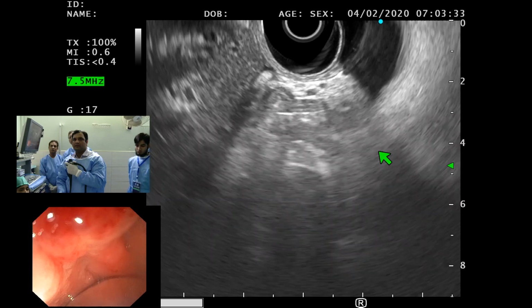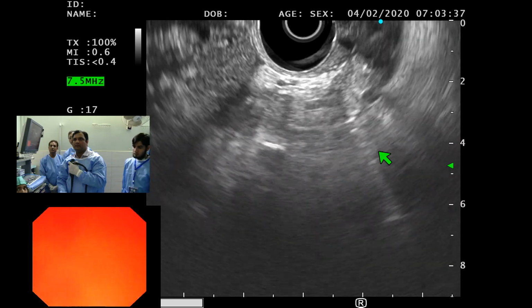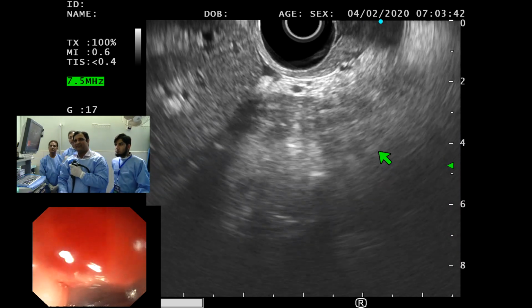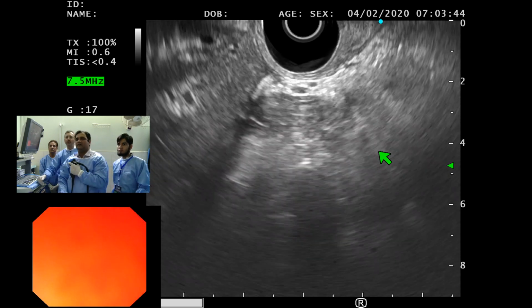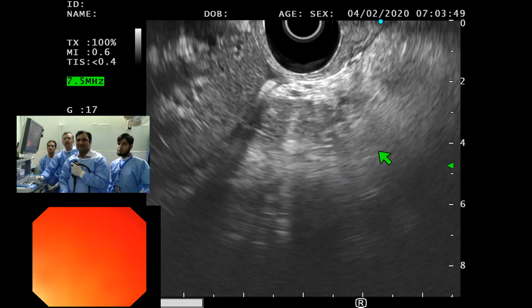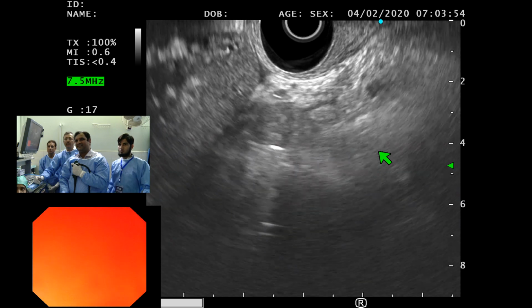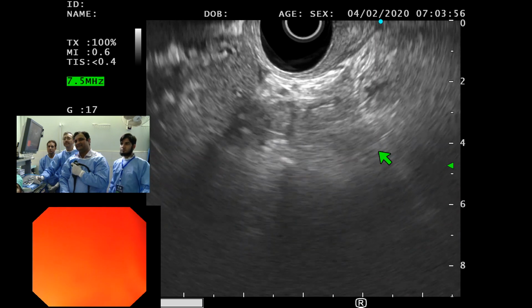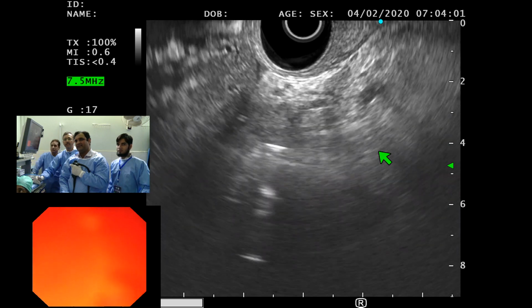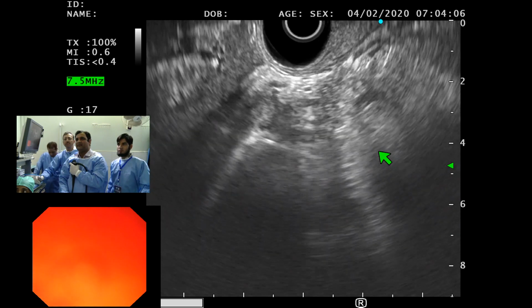Suction. We don't need a big balloon here. Why are we using the balloon? Shafkat wanted to put on the balloon because he was finding it difficult to keep the tip of his endoscope stable, so he wants a better stable position. Okay, so suck back. Keep sucking. You need a smaller balloon.